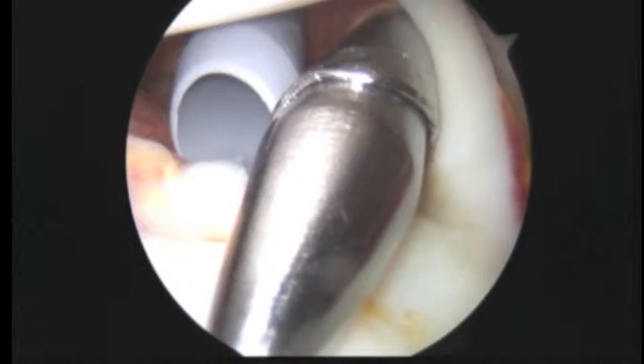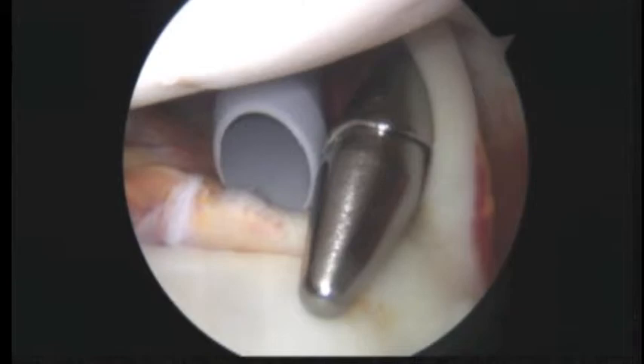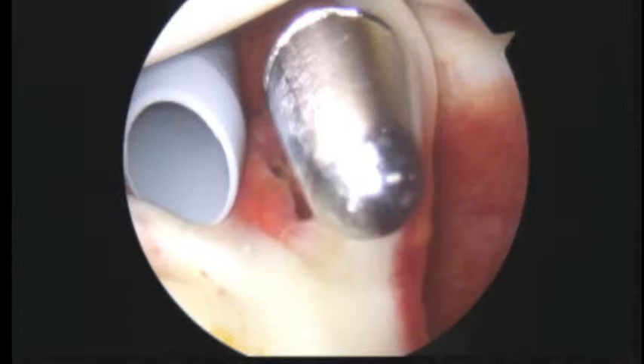We're just getting started here with your left shoulder. I'm here with Dr. Moore and the rest of the shoulder team. We examined your shoulder before we started and there was quite a bit of instability, so we know we're going to have to do that work that we've already talked about. What we're looking at here is these two cannulas coming through a part of the shoulder that we call the rotator interval.